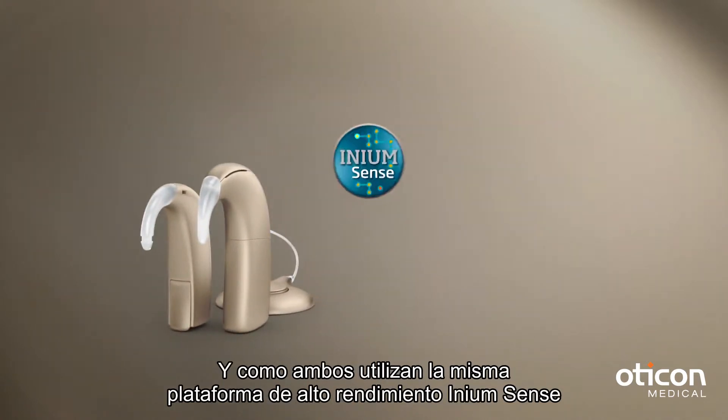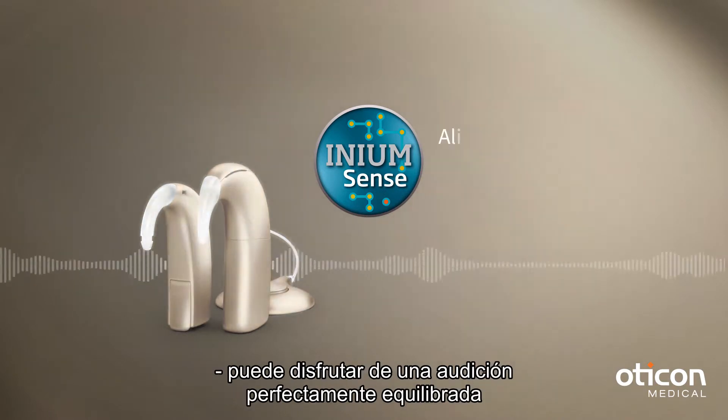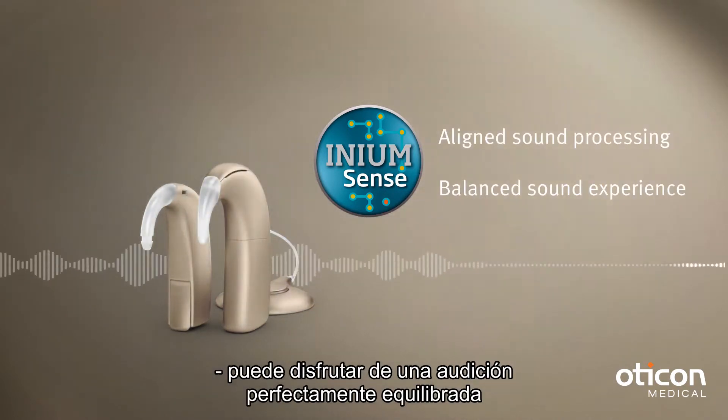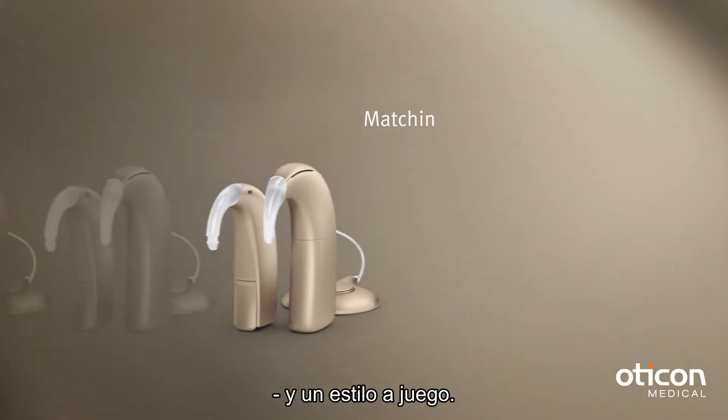And because both devices use the same high performance IniumSense platform, you can enjoy perfectly balanced hearing, as well as matching style.